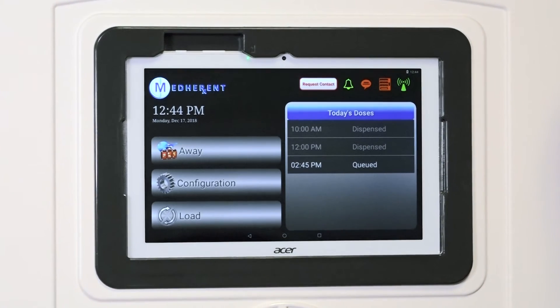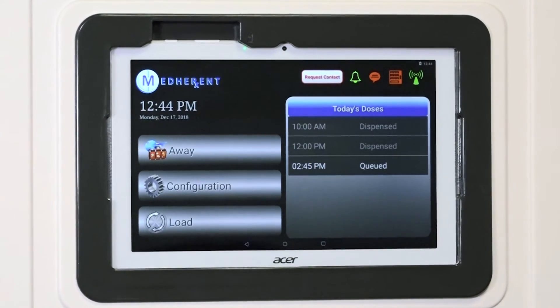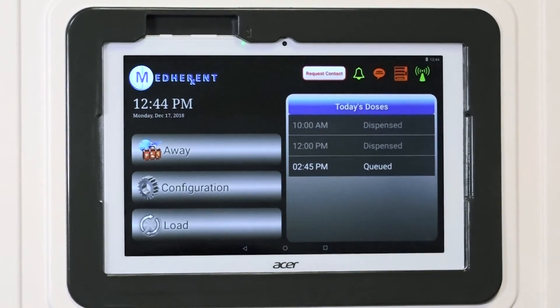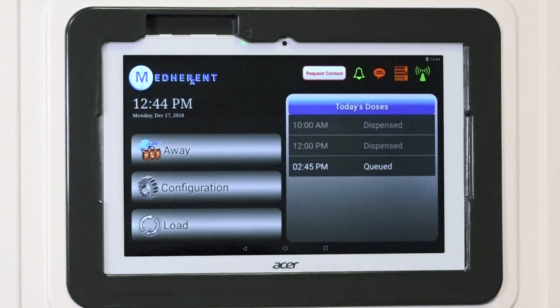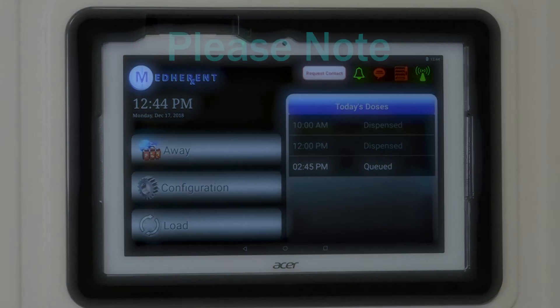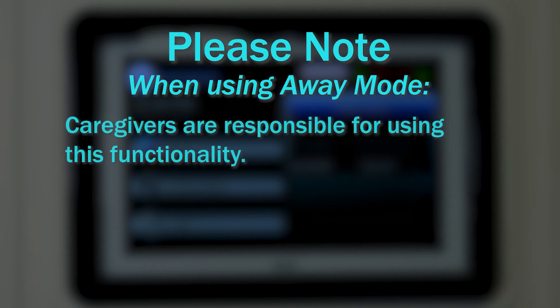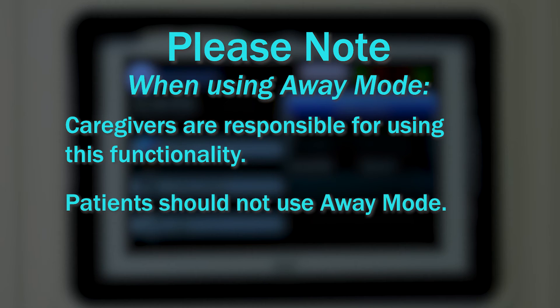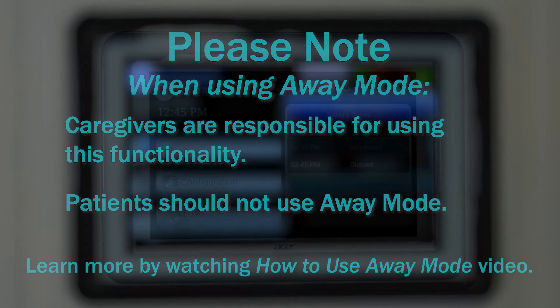Sometimes multiple days worth of medication will need to be dispensed in order to prepare a patient or client for a leave of absence. Medherent's Away Mode is designed to address these leave of absence situations. In the vast majority of situations where the Away Mode is needed, caregivers will be responsible for using this functionality and patients should refrain from pushing the Away button. If you are a caregiver, please watch the 'How to Use Away Mode' video training module to learn more.